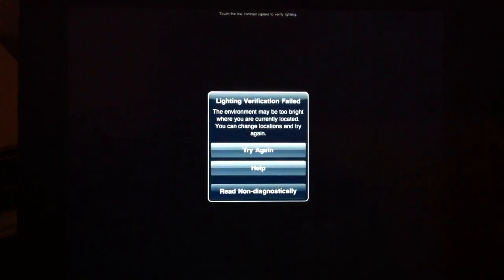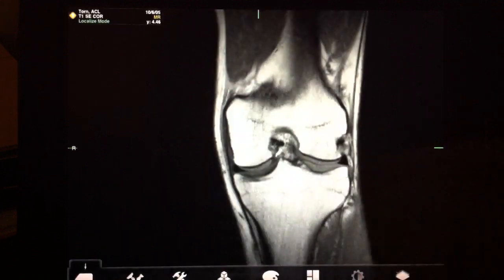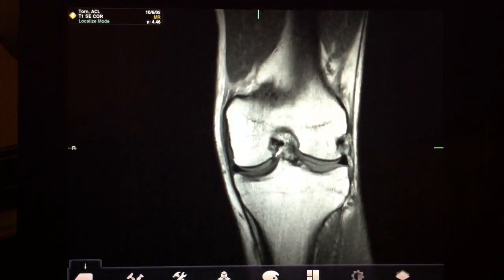If you try to verify lighting and you can't find the rectangle, it'll put up a warning saying that it has failed verification, but you can continue to read non-diagnostically.